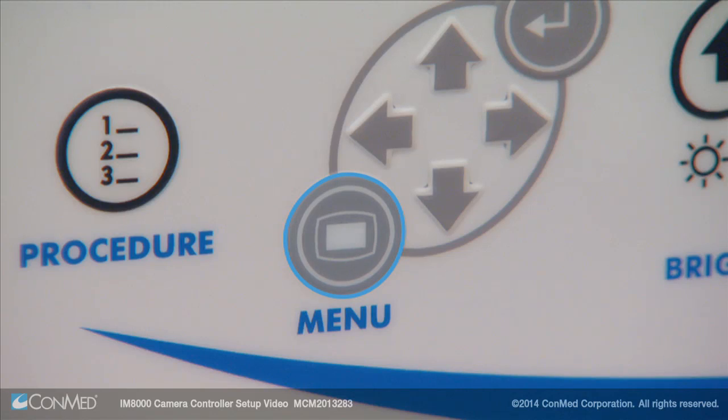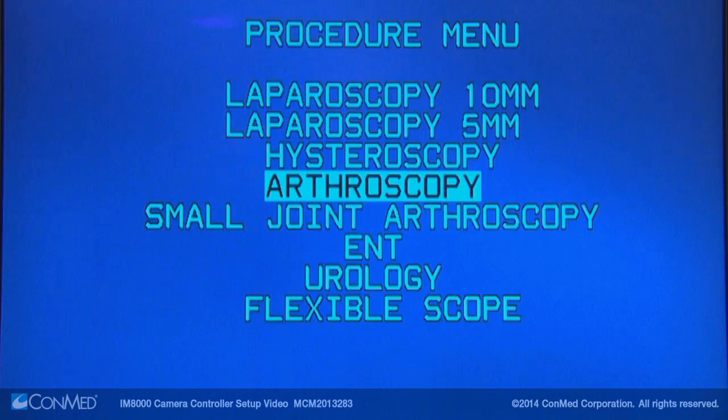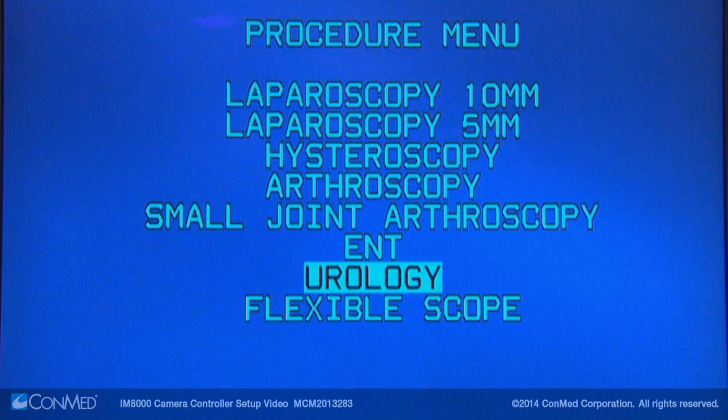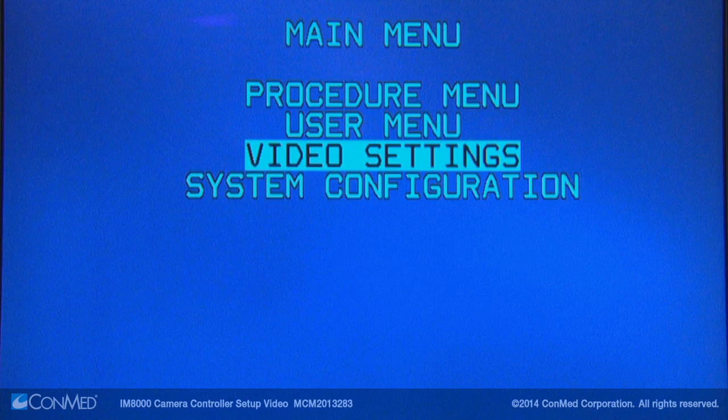Press the menu button to access the main menu. The procedure menu includes eight presets for common procedures. Presets will optimize the lighting and image for the selected procedure. The user menu holds user-defined presets. The IM8000 includes a comprehensive video settings menu.